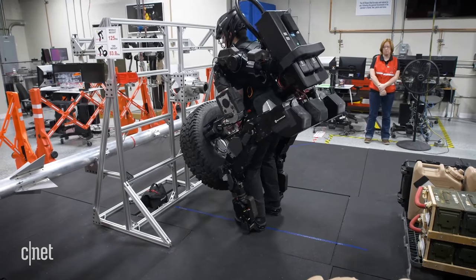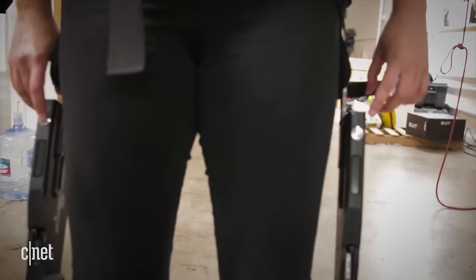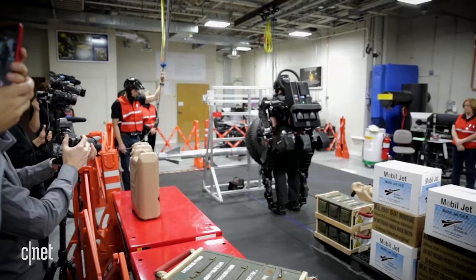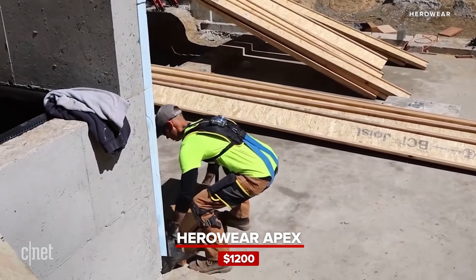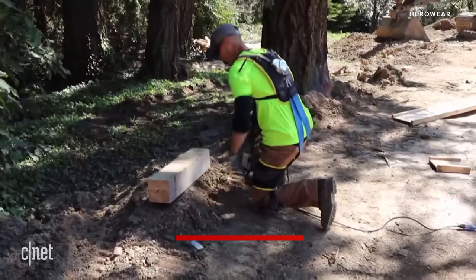Those suits are built to actually help you lift heavy things. They're full of electronics and motors, mostly designed to more or less make you stronger. Not surprisingly, they can cost thousands of dollars. The purpose of the Apex, which starts at $1,200, is not to make you stronger — it's specifically built to reduce strain on your back to prevent injuries.